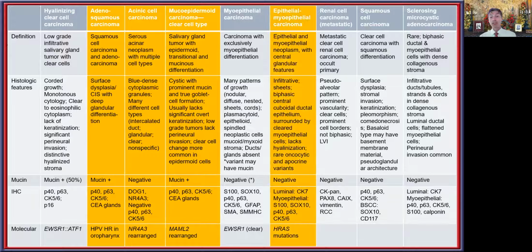The neoplastic infiltrate may not appear as clear in this particular case, and so when you think about it here, you can tell that there are these very well-developed areas of hyalinization or sclerous appearance, expanding into and actually compressing some of the skeletal muscle. But again, sometimes the neoplastic cells and histiocytes may be a little difficult to separate. So here is an example of more of a sheet-like appearance to the clear cell compartment, where you can have a bit more of a prominent and solid architecture, while in other areas it has a very well-developed acellular hyalinized stroma that is characteristic for this neoplasm.